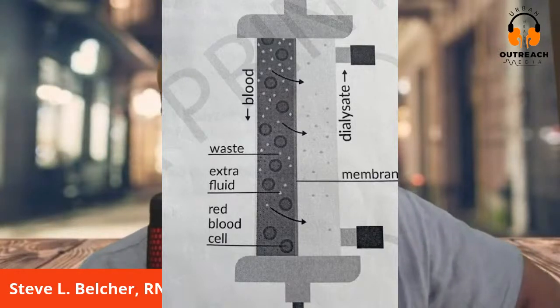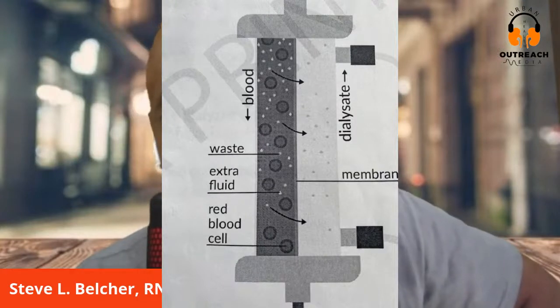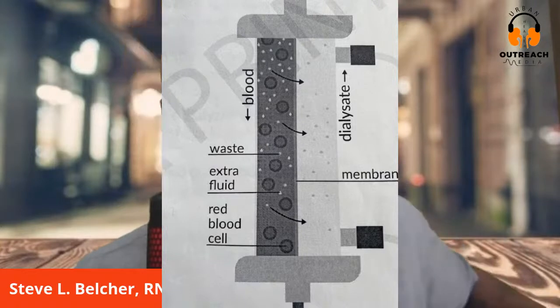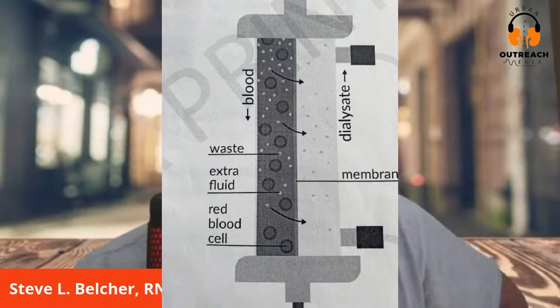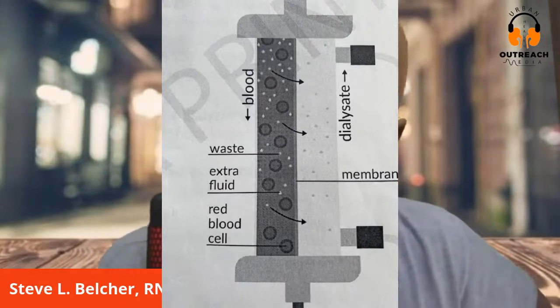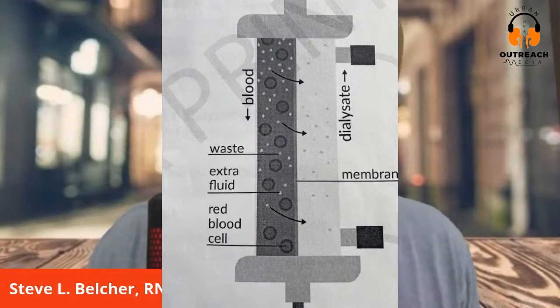And so what happens, that fresh dialysate, diffusion, it kind of balances it out, and it brings that waste over to the clean side, and it equalizes out. And then the extra fluid by negative pressure is being pulled off the blood, and it's going down the drain as well. And so the dialyzer acts as an artificial kidney.